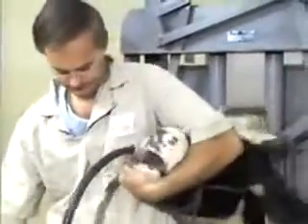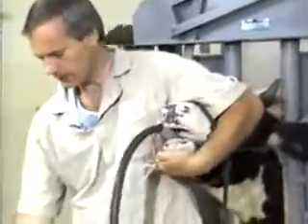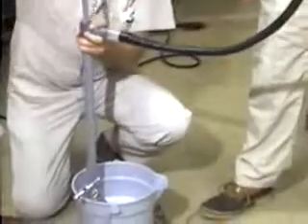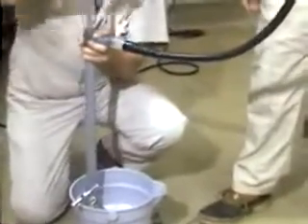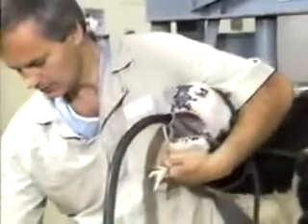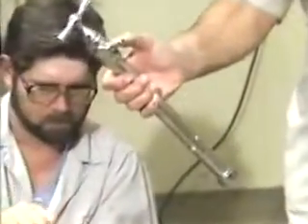Now we're ready to pump. An assistant can attach this onto a pump such as this bilge pump to pump fluids. We can also use this other pump — a metal version that's used to adapt onto smaller stomach tubes.